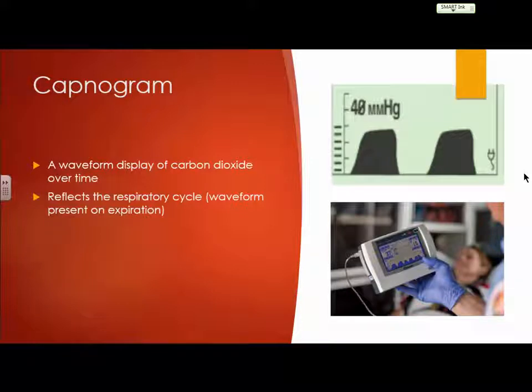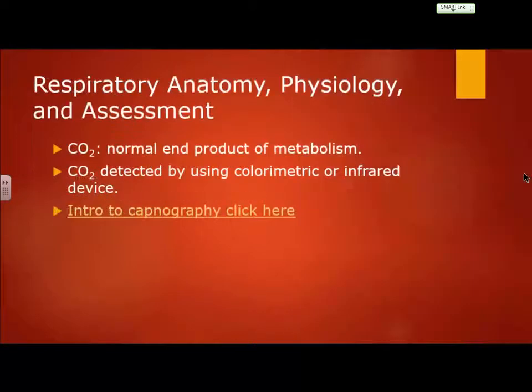Now, you're not going to really get a lot from acidosis, alkalosis, really, from anything here but the numbers. Now, what you would have to do is correlate, because we're going to talk about a couple of different waveforms, and you would have to correlate what that waveform looks like, then look at your numbers, and then maybe base your treatment off of that. Okay. All right. And I'll elaborate on that a little bit more in just a moment. All right?